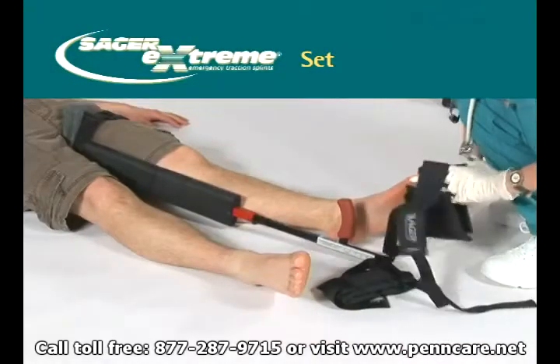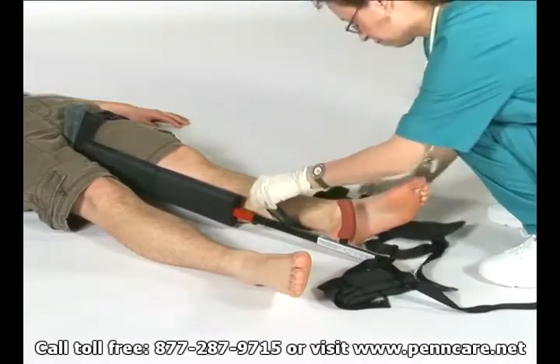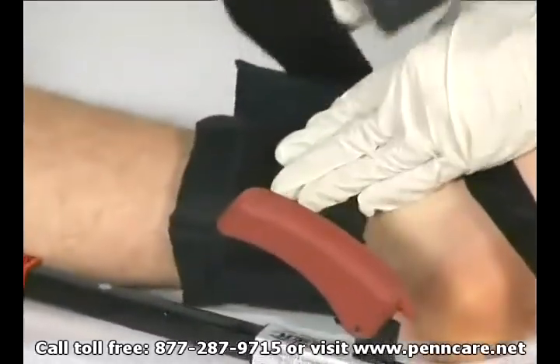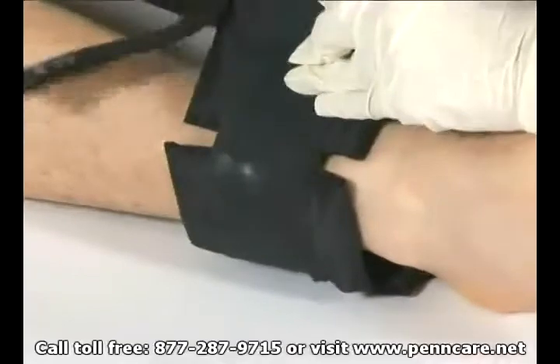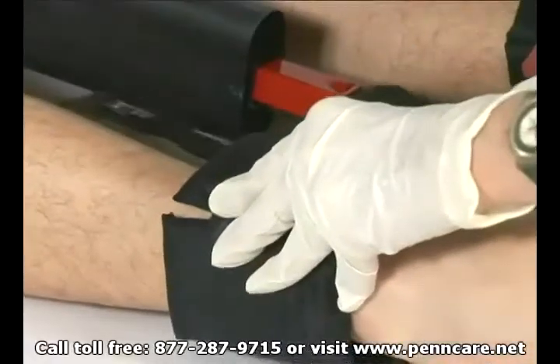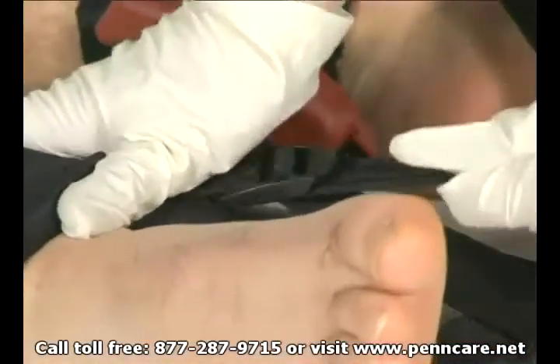Position the malleolar harness or ankle harness beneath the heels and just above the ankles. Fold down the number of comfort cushions needed to engage the ankle above the medial and lateral malleoli. Using the attached hook and loop straps, wrap the ankle harness around the ankle to secure snugly. Pull the control tabs to engage the ankle harness tightly against the crossbar.